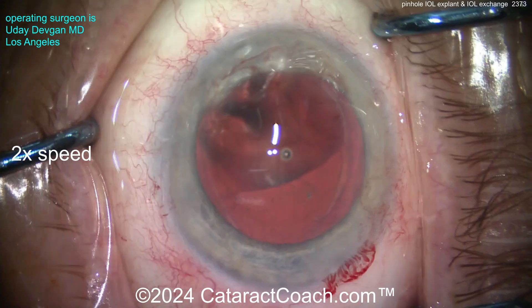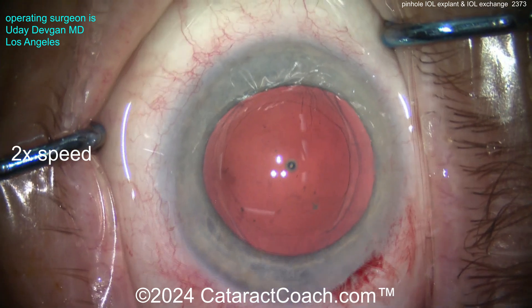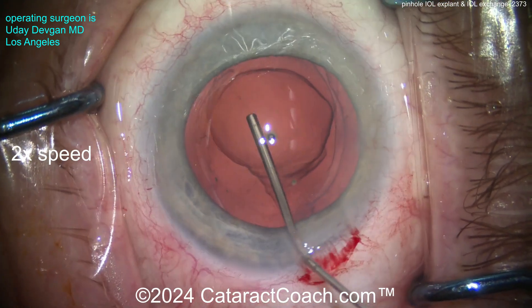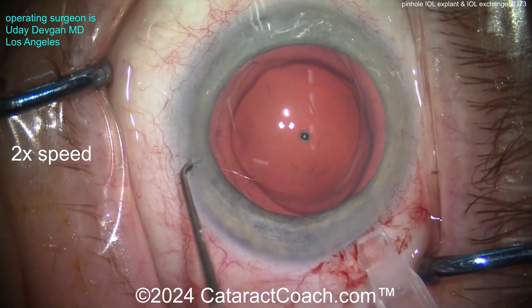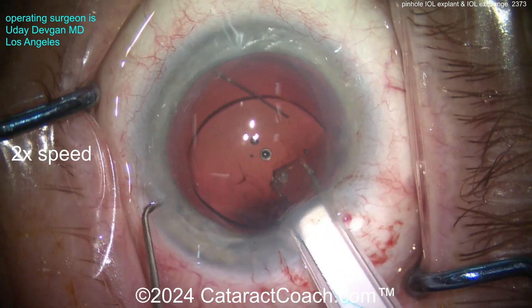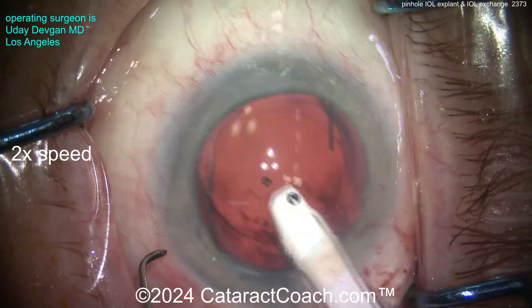Now we can get that off the surgical field and put our new lens in. In this situation the patient is going to get a monofocal three-piece silicone lens. The patient had all kinds of dysphotopsias from the original lens. Part of the issue, I think, is that in mesopic or scotopic lighting conditions the patient dilated past the outer ring — dilated about five millimeters — and in low light that caused lots of distortions.